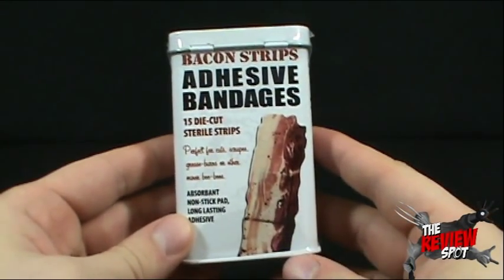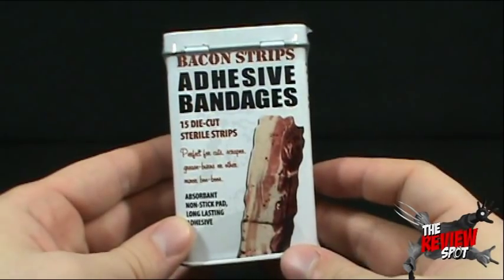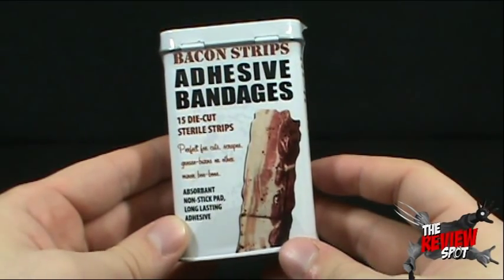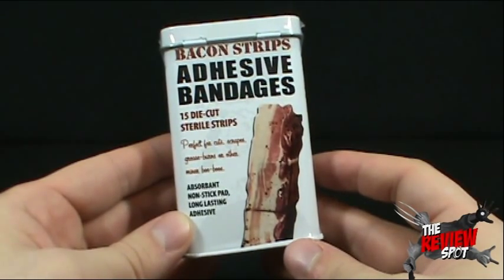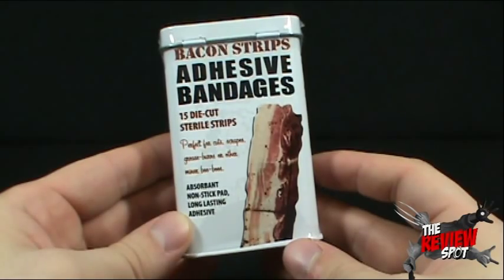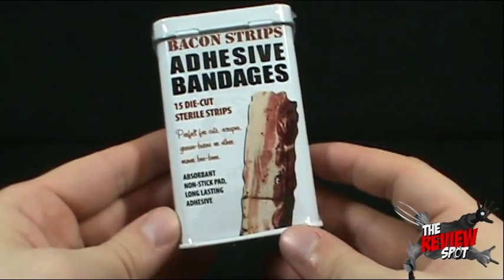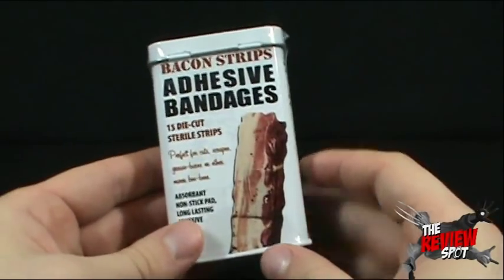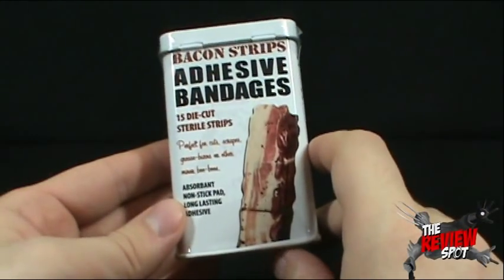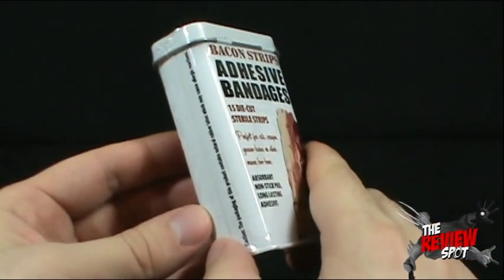This channel seems to be getting notorious for bacon-related items. I didn't plan it — somehow it just ended up working out that way. We're looking today at the Bacon Strip Adhesive Bandages. You get 15 die-cut sterile strips — perfect for cuts, scrapes, grease burns, because you might get grease burns when you handle bacon. I've been there. Or other minor boo-boos. Absorbent, non-stick pad, long-lasting adhesive. Even my cats are excited — you can hear them in the background saying, 'Bacon Strip Adhesive Bandages, we're totally there.'